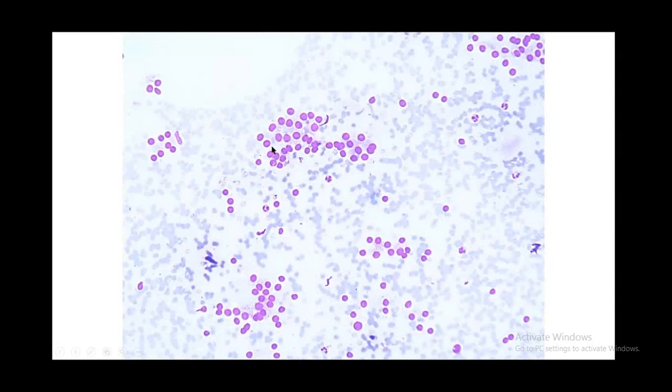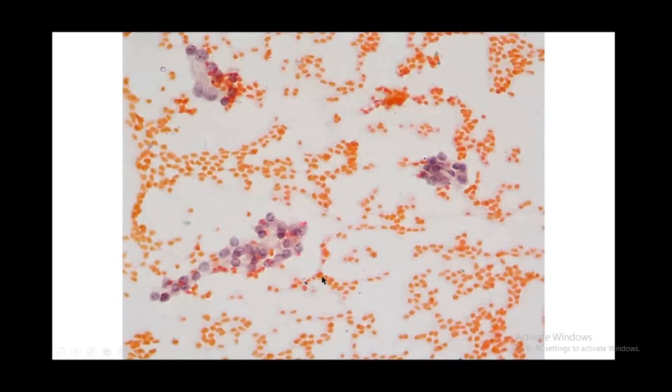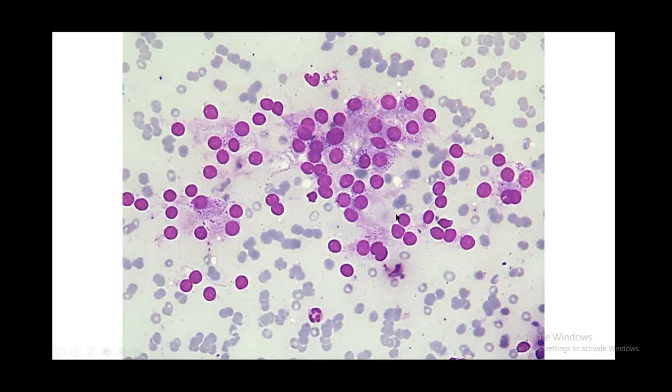If we have a closer look, we find that again there is hardly any nuclear pleomorphism. There weren't any nuclear grooves or inclusions, and the cytoplasm was pale and started showing some granularity. Many naked nuclei in the background, vascular fragments, cells with vague microfollicular acinar arrangement and cytoplasmic granularity. Pap stain also did not show any nuclear features of papillary thyroid carcinoma. Some anisonucleosis was seen, and again some clusters, but no definite papillae were identified.